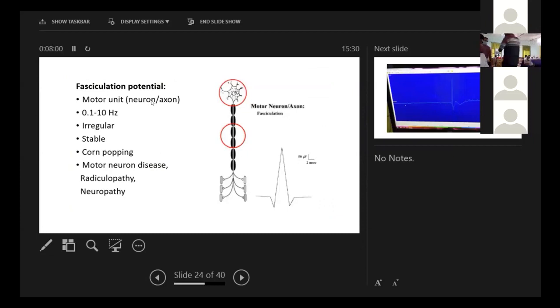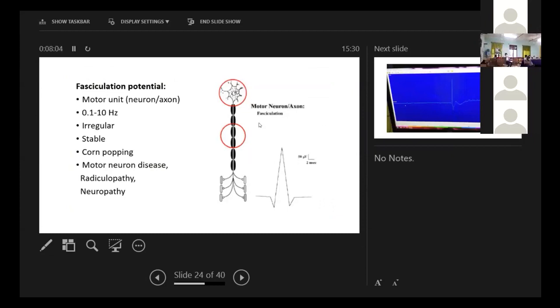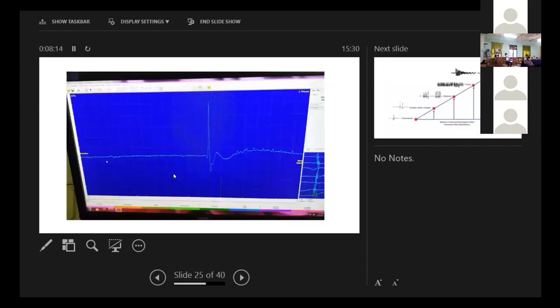Now coming to a fasciculation potential that comes from a neuron or axon that is irregular. And it's a corn popping sound. It is classically seen in motor neuron disease or neuropathy or radiculopathy. So it will look like this.